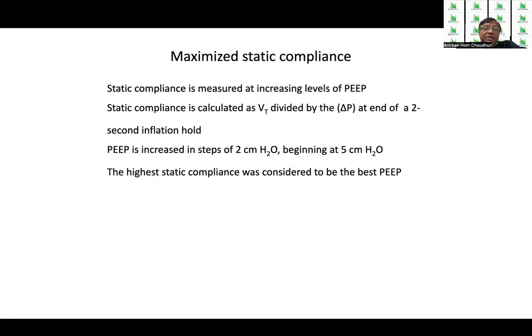Next is by showing the maximized static compliance. Static compliance is measured at increasing levels of PEEP. It is calculated as the VT divided by the change in driving pressure, that is, the plateau pressure at the end of a 2-second inflation hold. The PEEP is increased in steps of 2 centimeter beginning at 5 centimeter. The highest static compliance is considered to be the best PEEP.